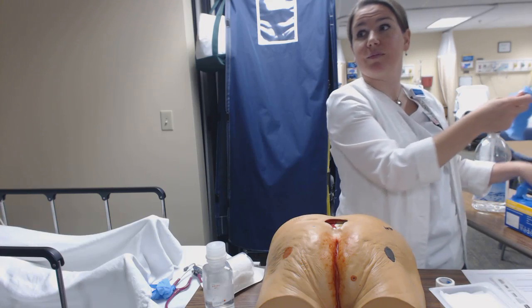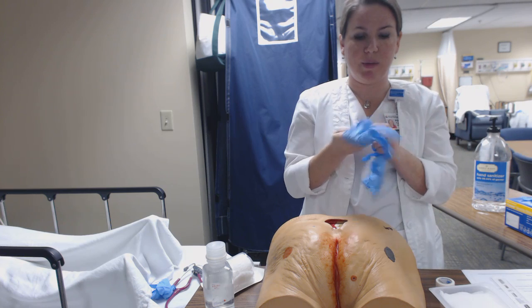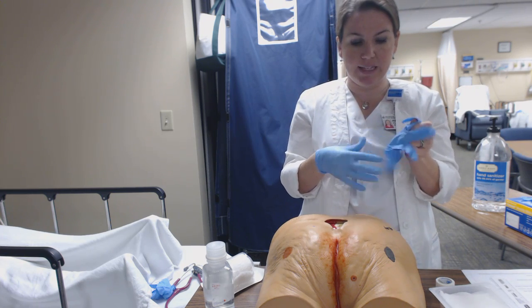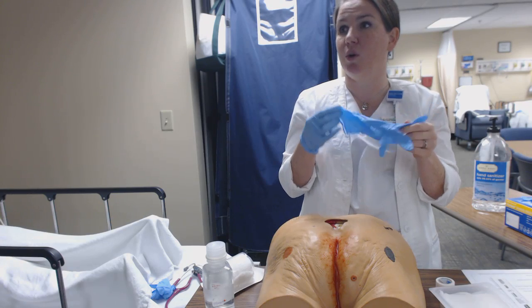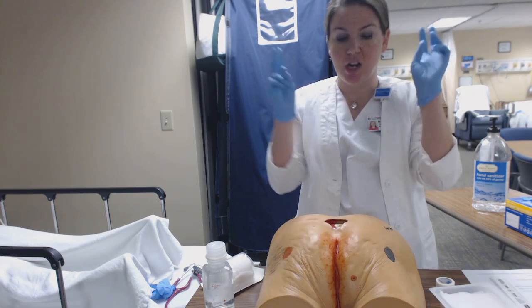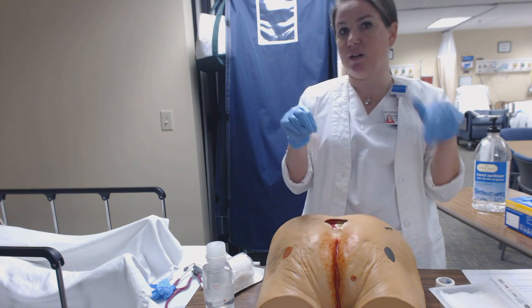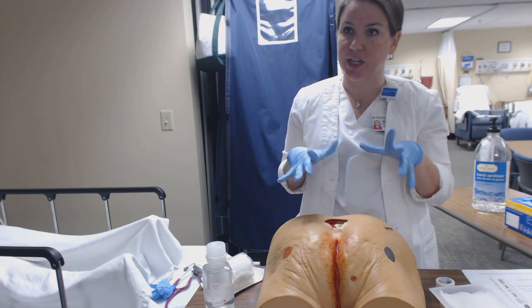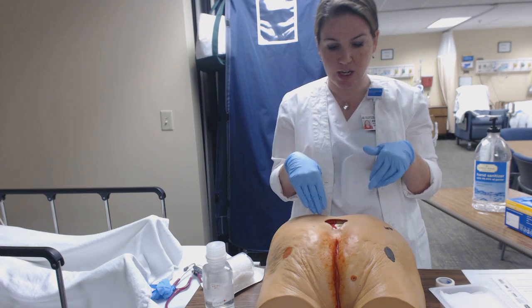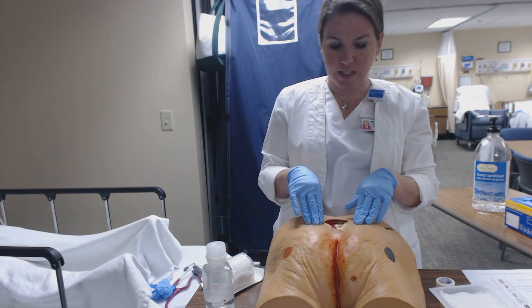So Miss KMB, why are you not putting sterile gloves on? That's a very good question, Miss Palmer. So at the beginning of the video, we talked about that this is not a sterile wound. So this wound is what we consider dirty. Now, dirty doesn't mean we want to go outside and get dirty ourselves and then put more dirt in there or sneeze in our hands and do the dressing change. That's not okay. It just simply means that it doesn't require sterile dressing.